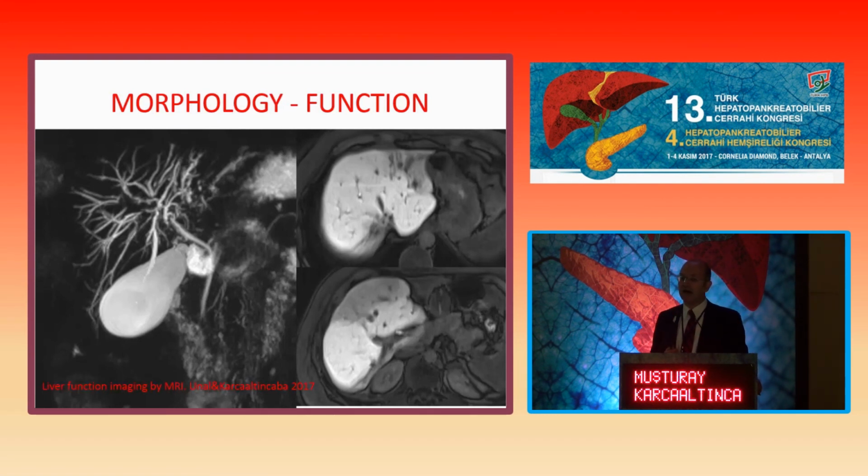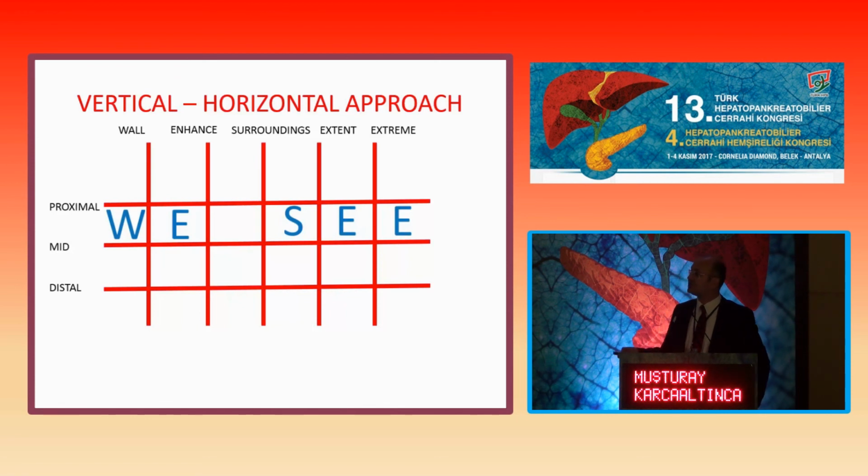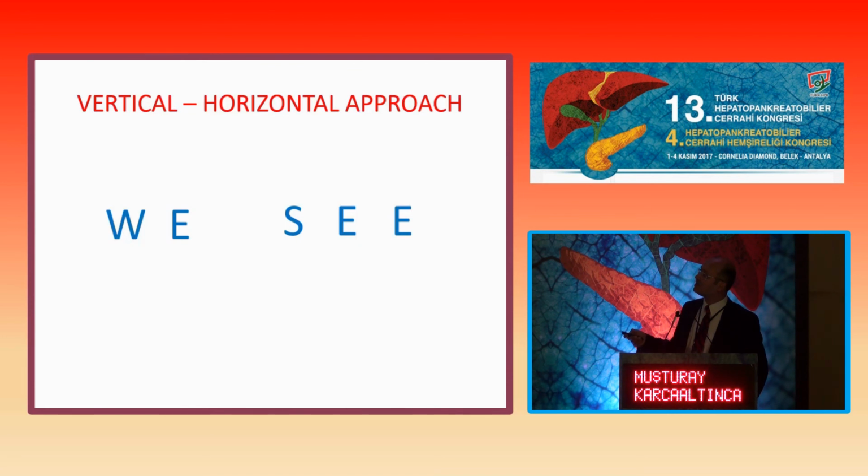And really, technology is very available to us. You can see different liver segments. We can calculate the volumes and also the function. So this is a recent article that we published, and you can see in addition to these images, you can show dysfunctioning or atrophic liver with Primovist.